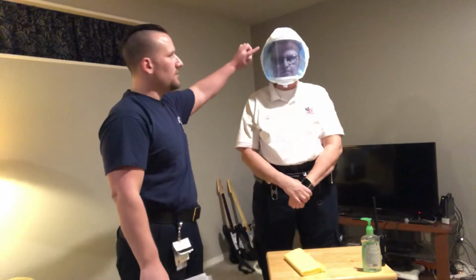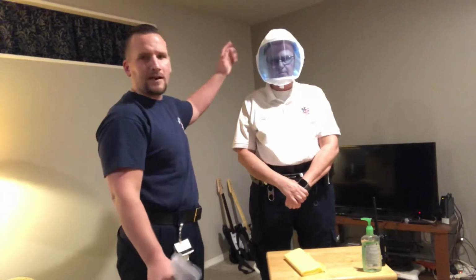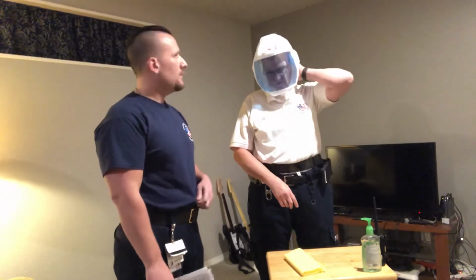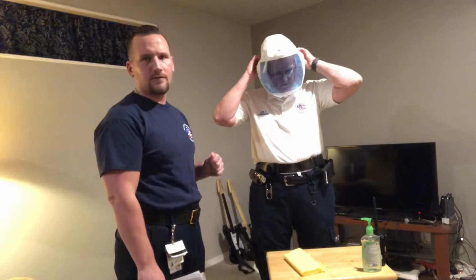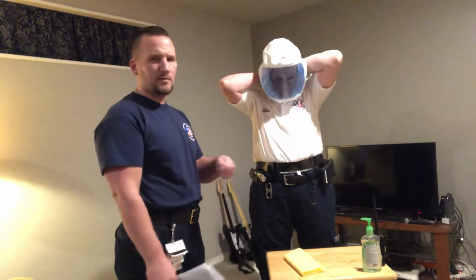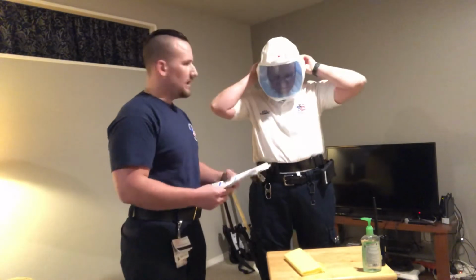This blue film that you see, take that off. New hoods come with this film. When you go to use it, just peel the film off. It's fine for demonstration purposes, but when you're actually in the field going to use it, just peel the blue off. It's a little easier. All right, let me step back.